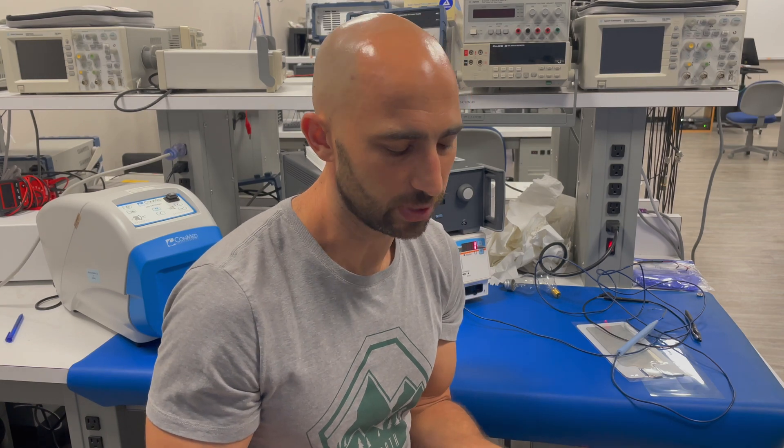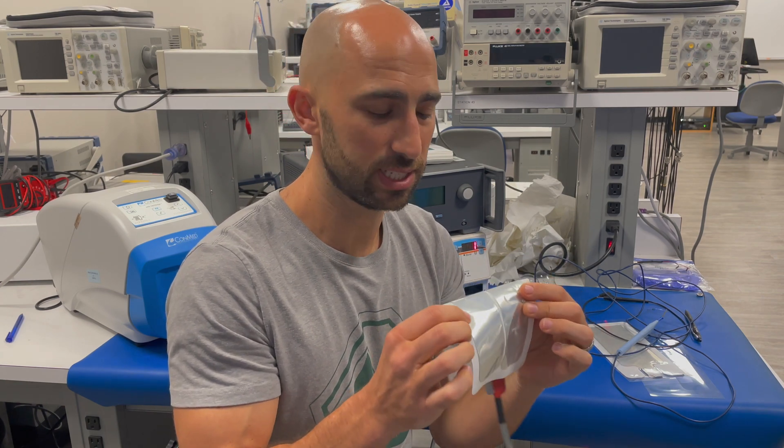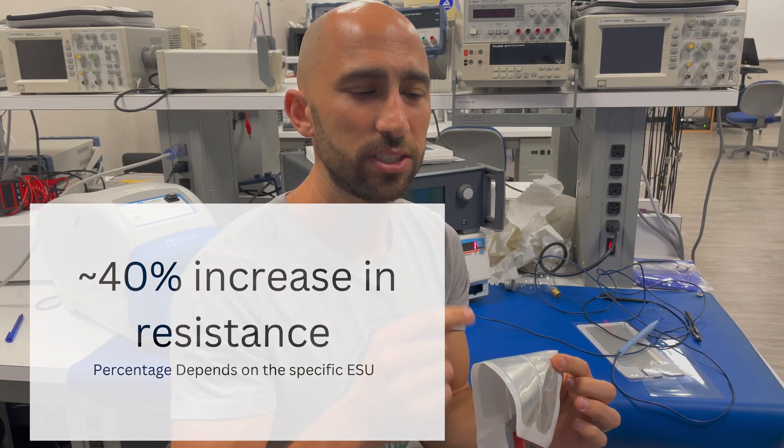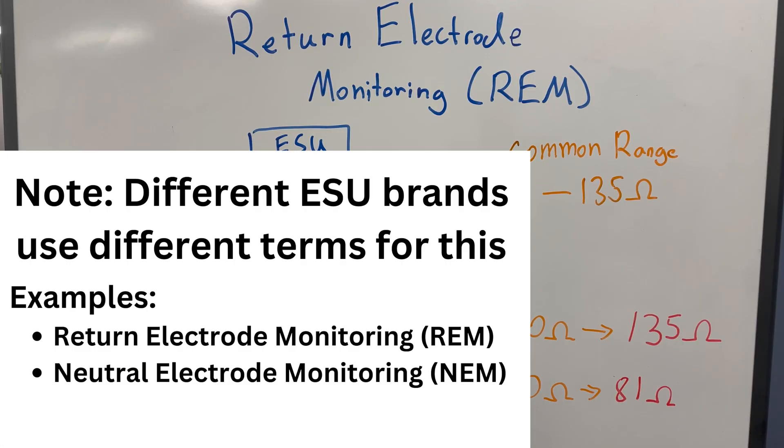The reason that happened is because there's a circuit that measures the resistance between these two electrodes. If that resistance gets too high — based on a certain percentage threshold — the system says, wait a minute, something's happened to the return electrode. Stop the ESU; we're not going to cut until someone fixes that return electrode. Let's take a look at the circuit for return electrode monitoring, also known as the REM circuit.